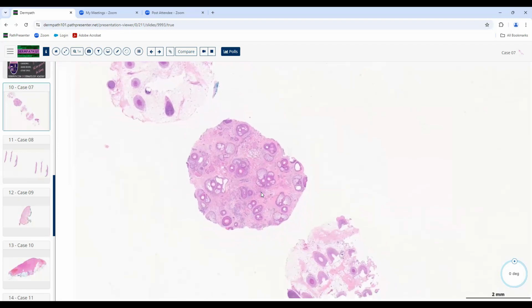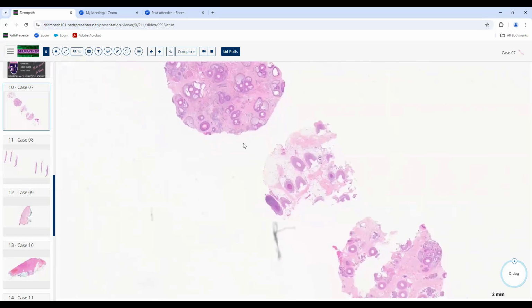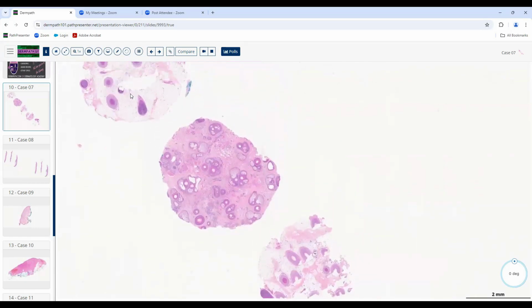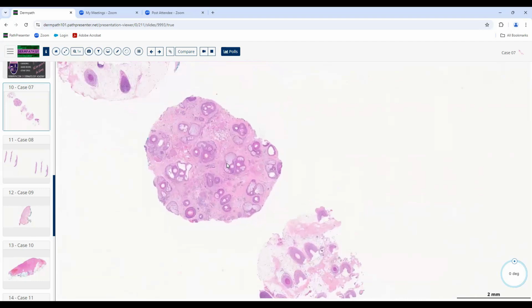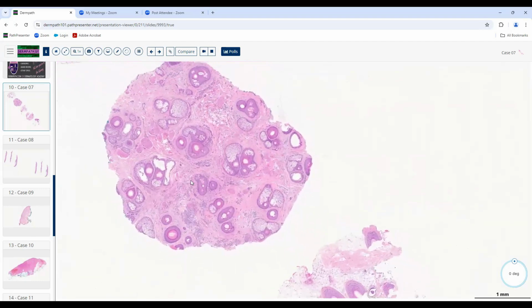One of the reasons this was developed years ago by Dr. Headington, who was a dermatopathologist in Michigan that was interested in hair and also adnexal neoplasms. He said, well, if you just look at a regular punch biopsy and you just cut it in the typical fashion, you're only looking at about 8 to 10 follicles. If you cut it in a horizontal fashion, up, say, near the infundibulum and then down maybe near the lower part of the follicle, you can see about 20 to 30. So you can really assess a lot more of the hair follicles.